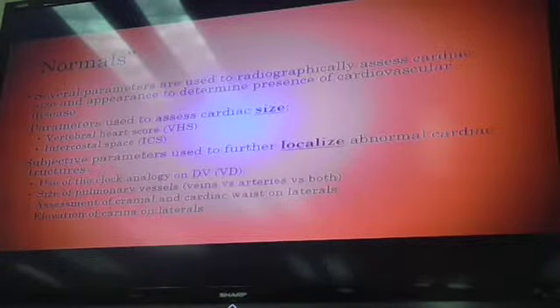So what you guys will find by the end of this semester, when we give you cardiac cases, you will have quickly made a quick assessment based off of a couple of these that you can quickly visualize and say, okay, do I need to jump to further parameters to further support my findings, okay? And that's taking into consideration what your patient's presenting complaint is and what his history is and what his physical exam findings are, all right?